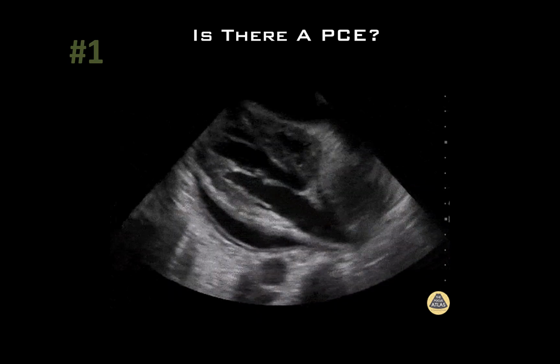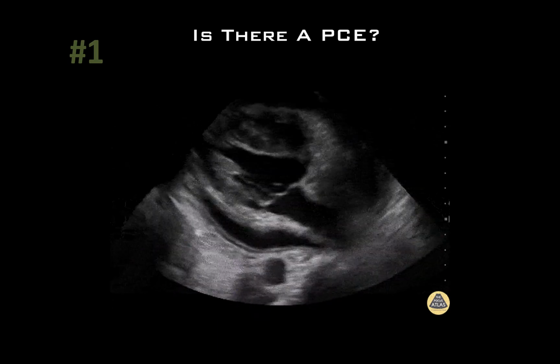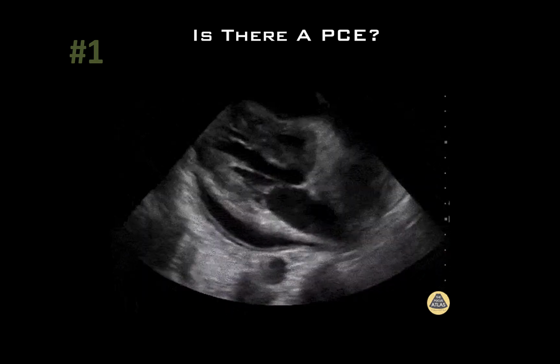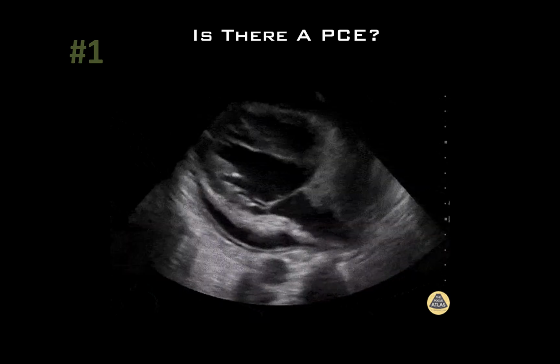For the sake of the RUSH exam, advanced interpretation of tamponade physiology, including nuances in diastolic dysfunction, right atrial and right ventricular collapse during different phases of the cardiac cycle, is not assessed here. The question here is binary. Is there a pericardial effusion or not?